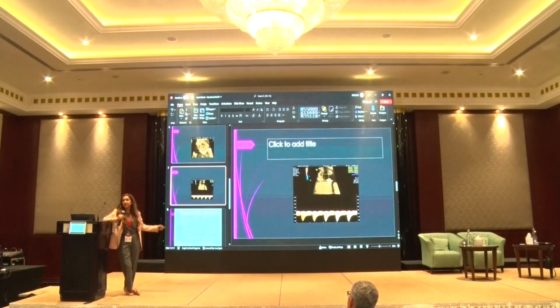I'm trying to get the atrial and the ventricular contraction rates, which I cannot do in M-mode. So the only other way I can see if the atrial and the ventricular beating rates are different is by trying to put the two waves together. Yes. Correct. Yeah, so this is a 2:1 heart block, second degree heart block. But as I said, the M-mode was tricky, and not every time you can get a nice M-mode. So this is the other way of checking your atrial and ventricular rates.